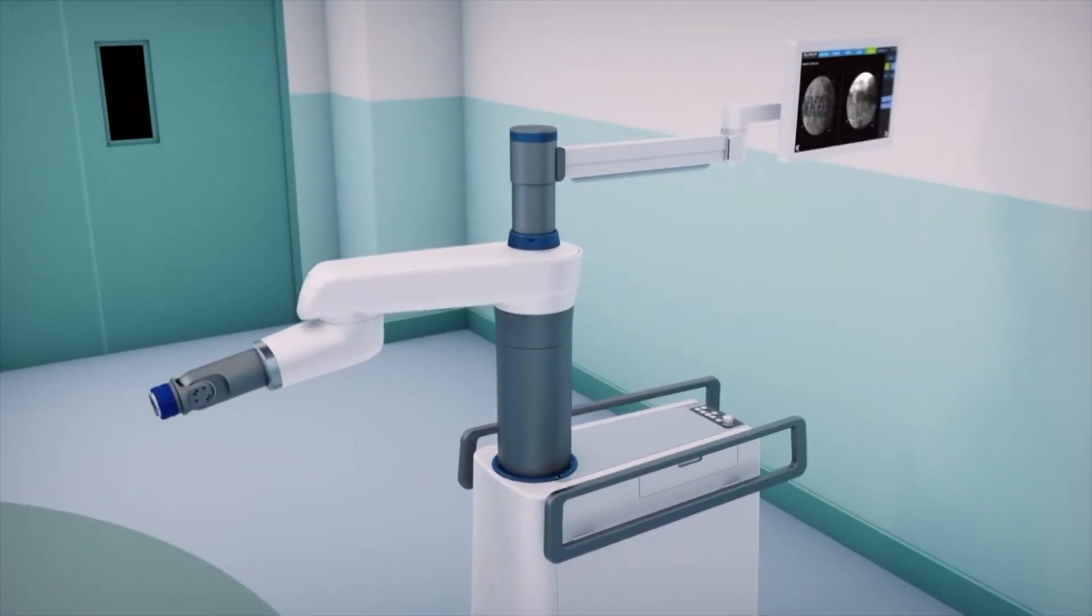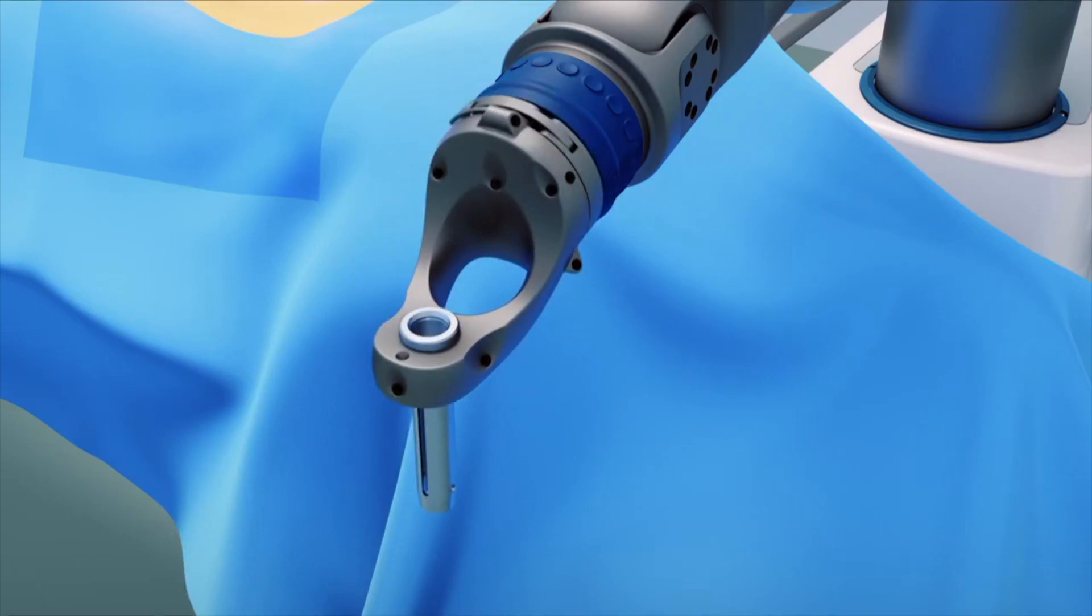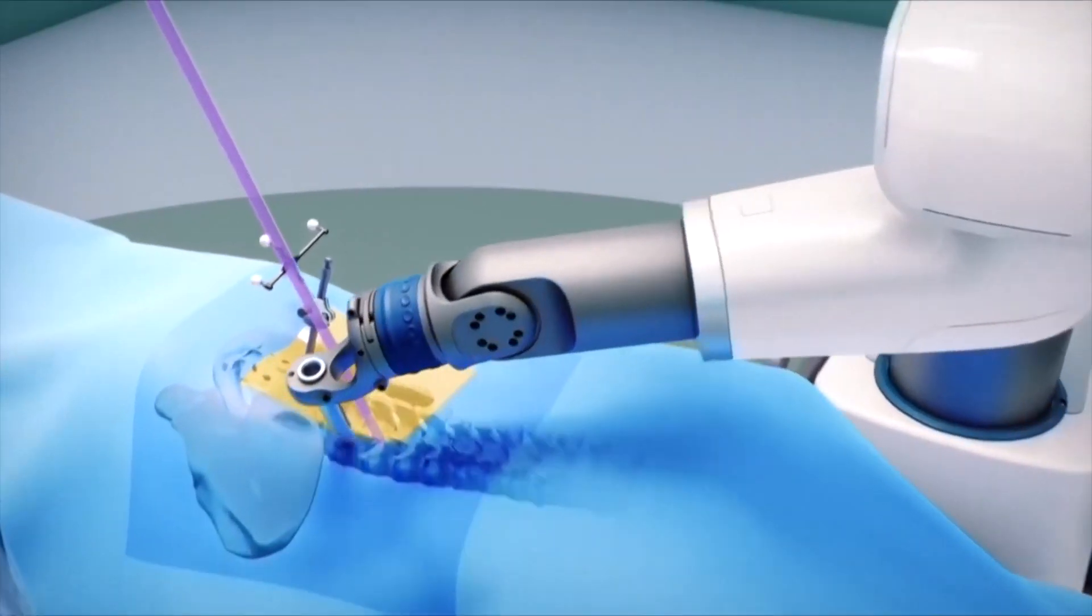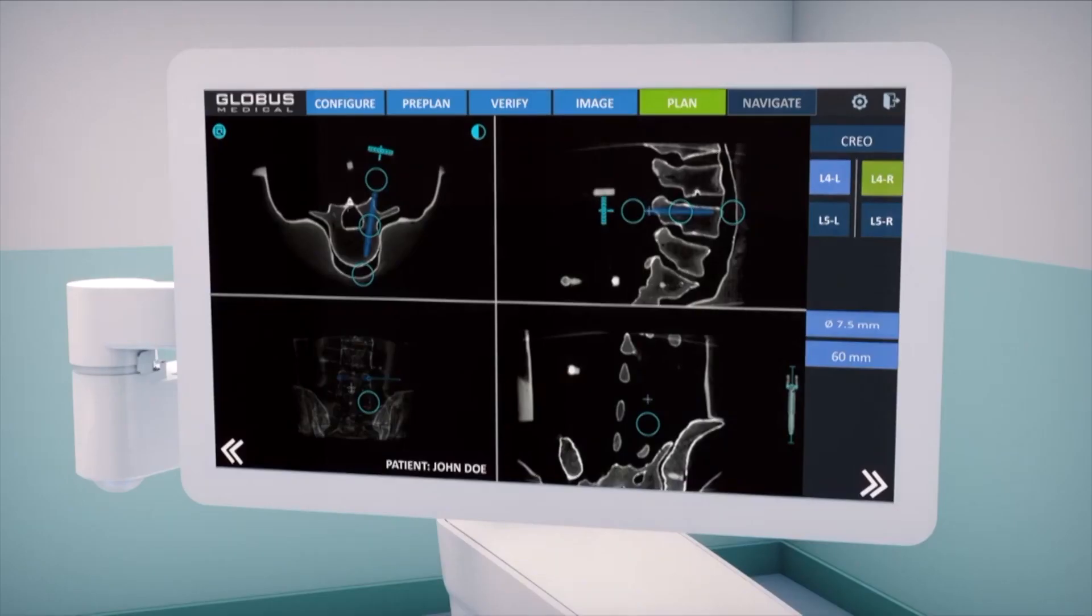Excelsior GPS third-generation spine robotic system uses the rigid robotic arm for the placement of implants in the spine. The implants are planned using CT scans of the patients.